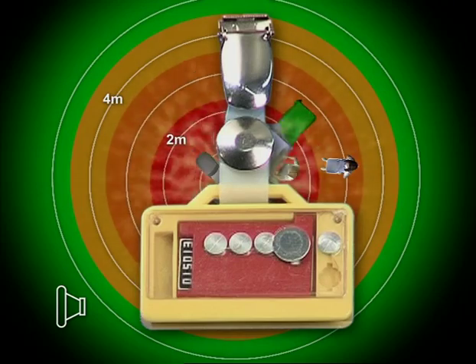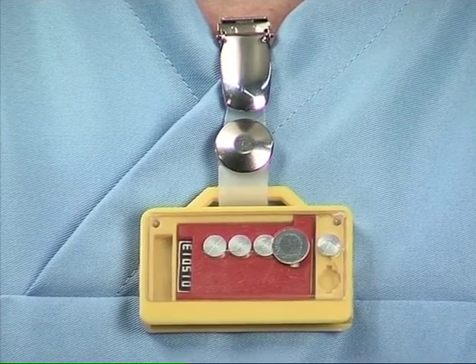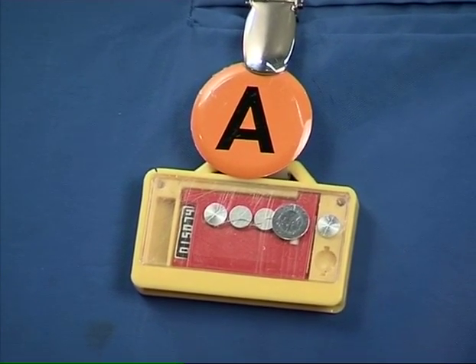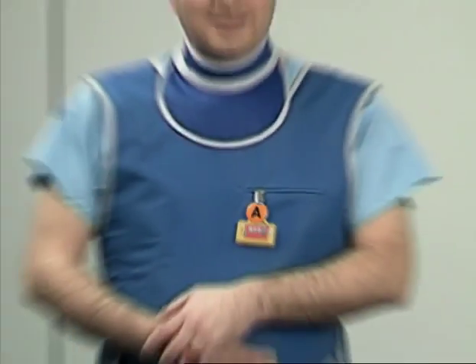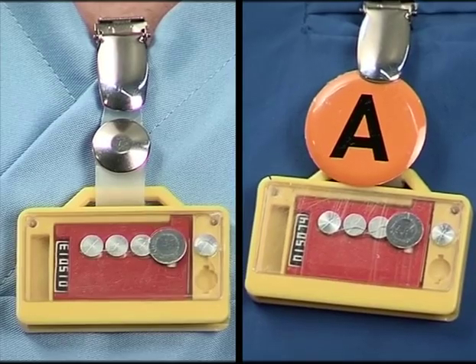The following points must be observed when wearing dosimeters. The whole body dosimeter is worn on the torso at chest level, or in the case of pregnant women at stomach level, under protective clothing. A second dosimeter should be worn over protective clothing in high-dose situations, such as interventional examinations. These devices must be appropriately labeled to avoid confusion during evaluation.